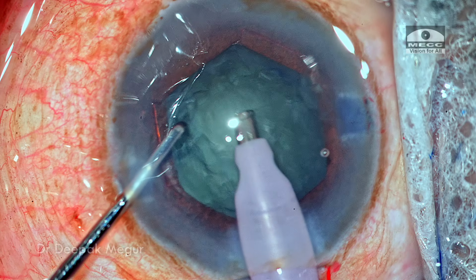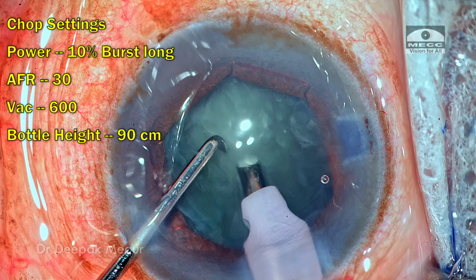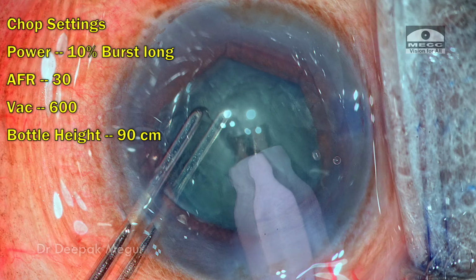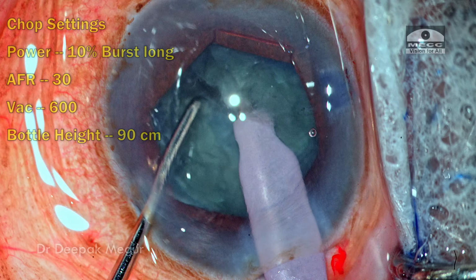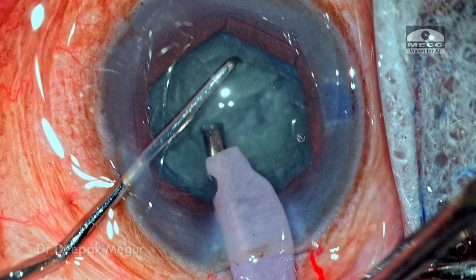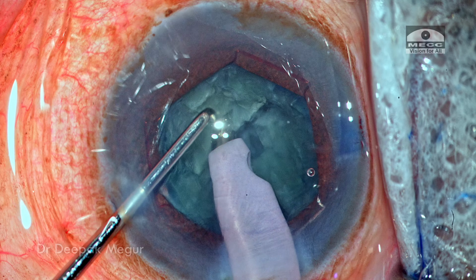Because this nucleus is relatively soft, the parameters are going to be significantly lesser. For chop setting, I'm going to use a power of 10% longitudinal. Just support the nucleus with the phaco tip using very little energy, and then the vertical chop is done. The nucleus is rotated and the nucleus is now being divided gently into smaller fragments.